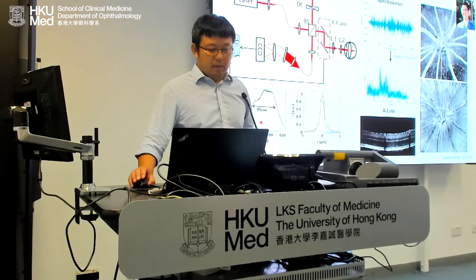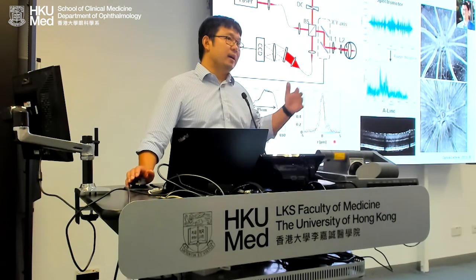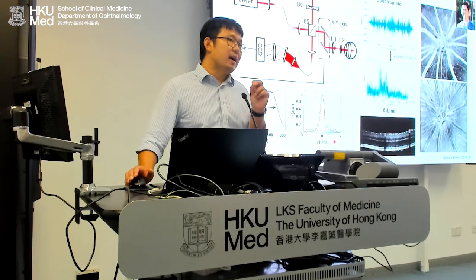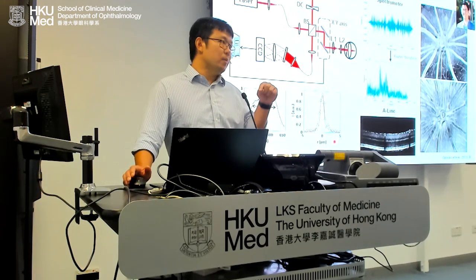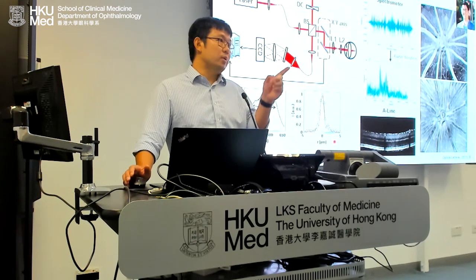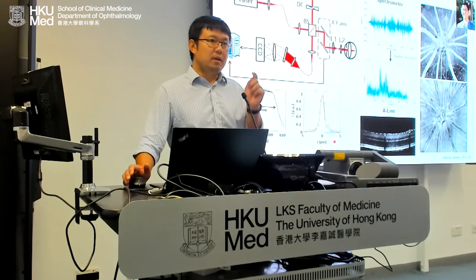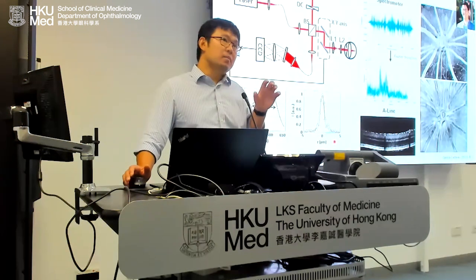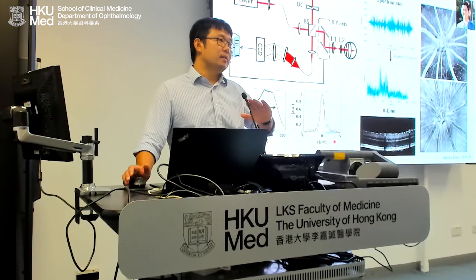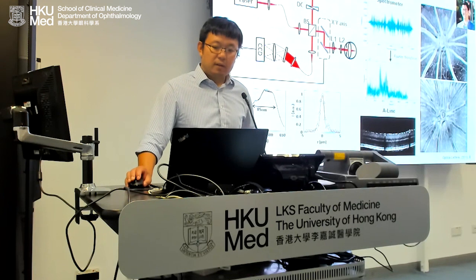This is the bandwidth from 510 to 610 nanometers at 3 dB bandwidth. It transforms to a point spread function, which is a resolution in air of around 2.9, around 2-ish microns in air. And if we scale by the refractive index of biological tissue, which is 1.33, we have around 2 micron spatial resolution in the eye. And I'll give you a rule of thumb: most clinical OCT machines have 5 to 10 micron axial resolution. That's the ballpark estimate. So if you look at this, these are from the mouse.